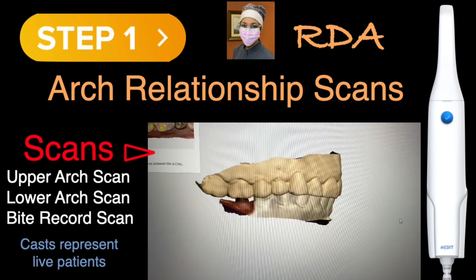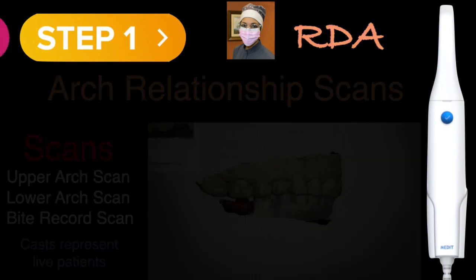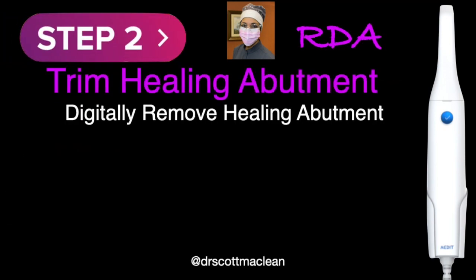So whether it's CO or CR, it can capture whatever you want to capture. You could just articulate the jaw exactly where you want to go. I like the feedback as you're going through the reliability test, because it gives you some kind of way to know that you have a good scan.